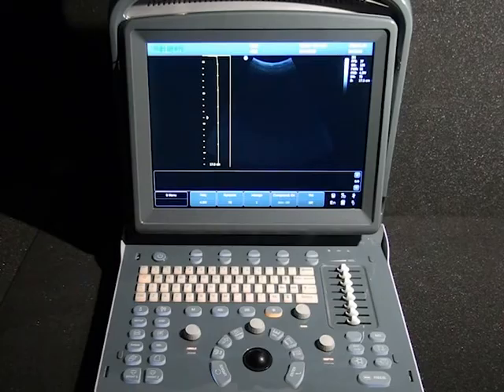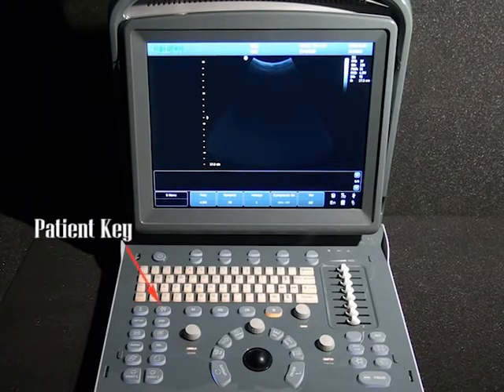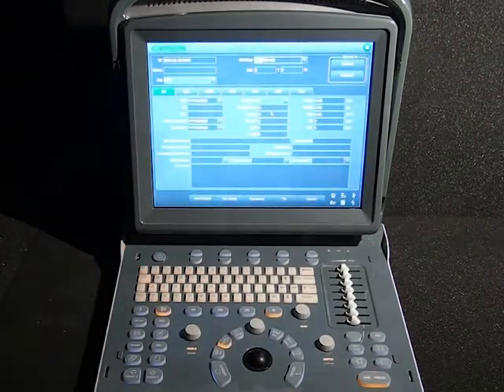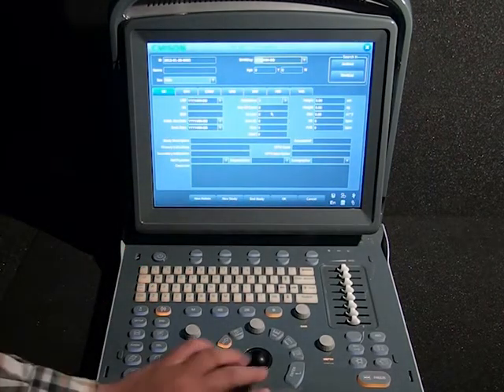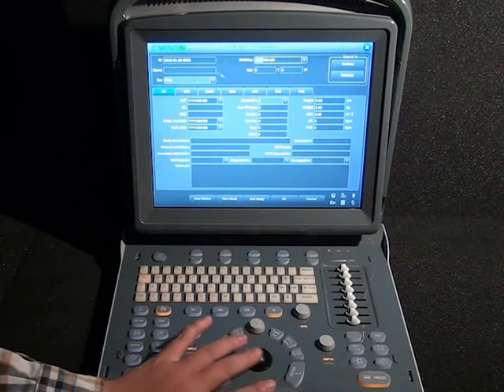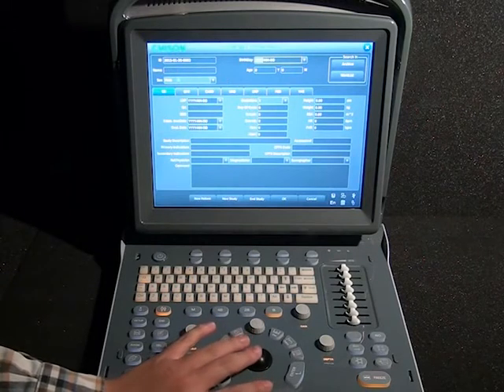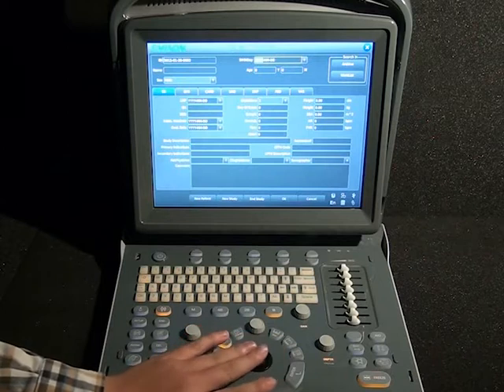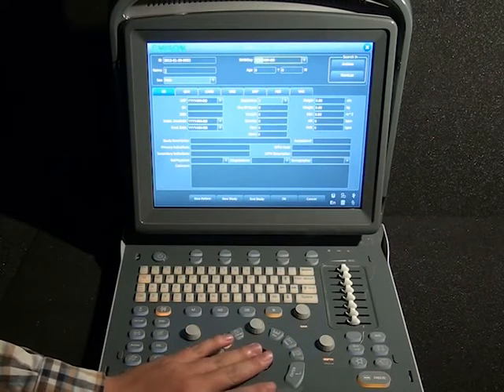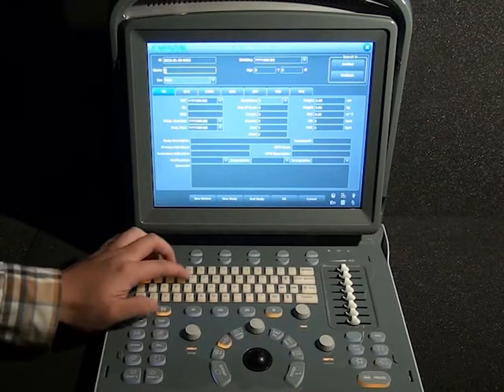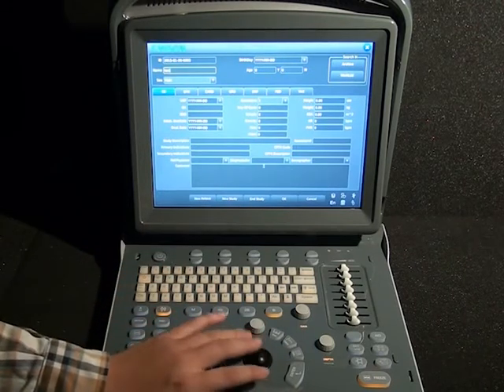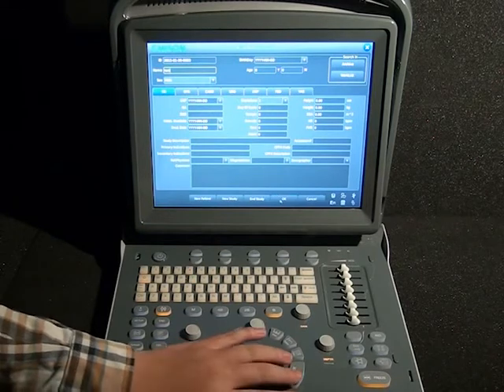When the system is ready, we are going to establish the patient's information. Use the patient key to start a new patient record and add the current patient data: patient ID, patient name. You can input any other information you want. When ready, click OK to save it.